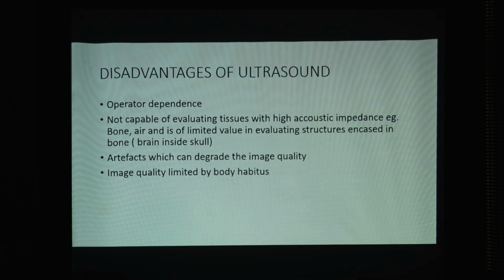Disadvantages are mainly operator dependence. Then it is not capable of evaluating tissues with a high acoustic impedance, that is bone, air, and is of limited value in evaluating structures encased in bone like the skull. Artifacts can degrade the image quality. Then for obese individuals it is very difficult.